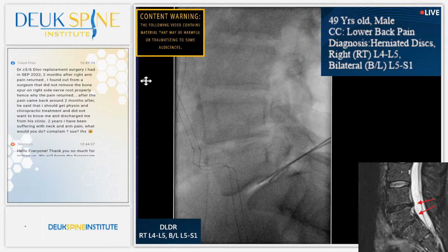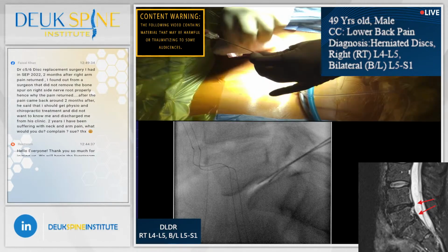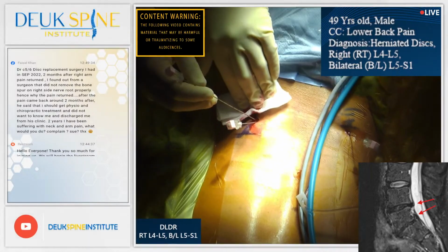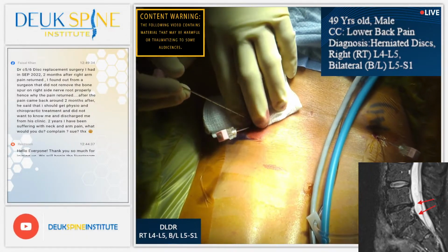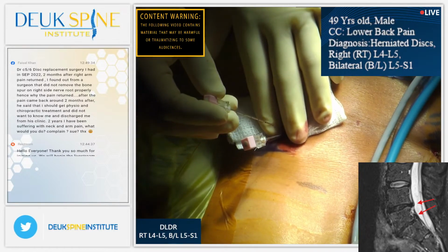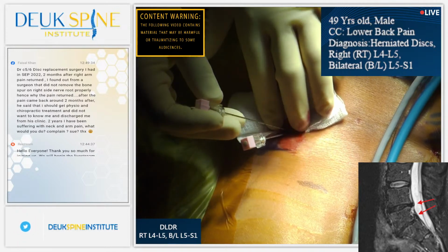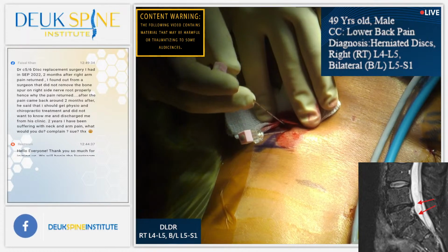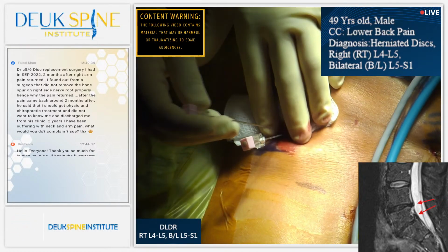Well, I don't know how we did it, but we got lucky. Right, Luis? Better to be lucky than good. So we've already numbed up his skin a bit. Now we're going to place our, everyone agree, right 4-5, right 4-5, yes? Okay, feel it in your back? All right, that's okay, that's normal. You're doing great, everything's okay.